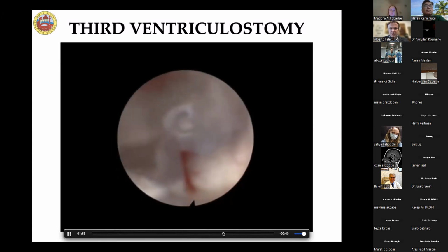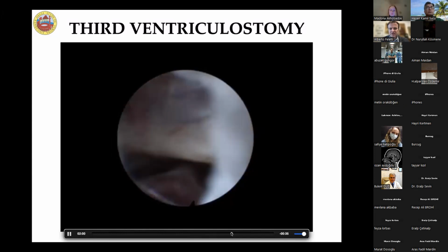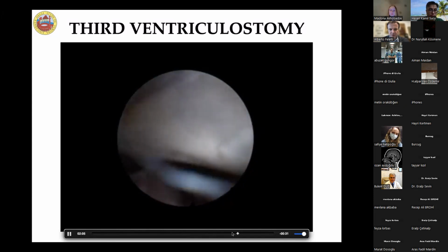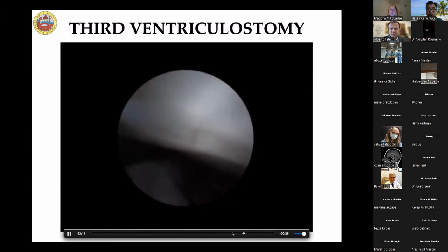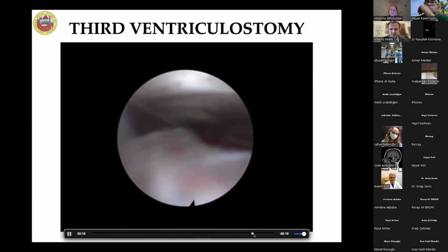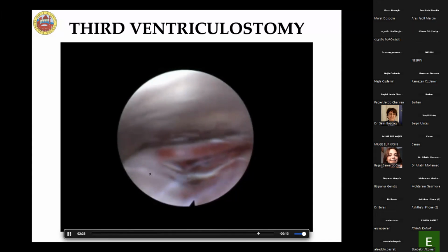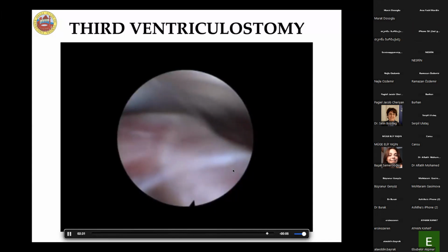In almost all cases, when I had this kind of intraoperative problem, I just did irrigation and the bleeding stopped. In only one case, I had to use the dry field technique, which is basically the removal of CSF from the ventricles. In that case, the bleeding stops basically immediately after removal of the fluid, and the vision is much clearer. It's always a good habit after performing the ventriculostomy to inspect the cistern to make sure that no other membranes are present.